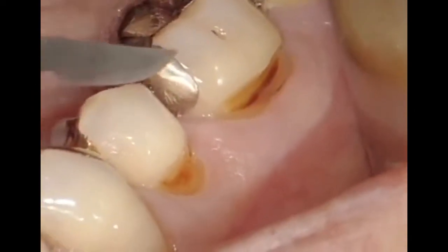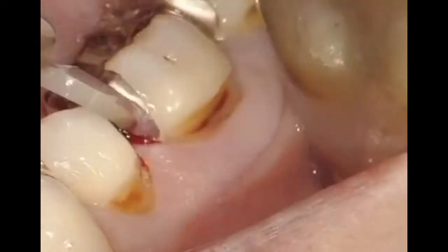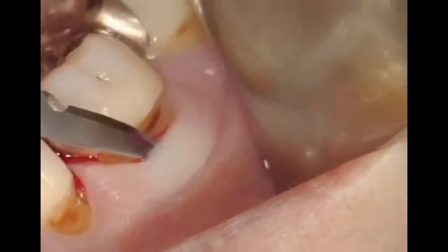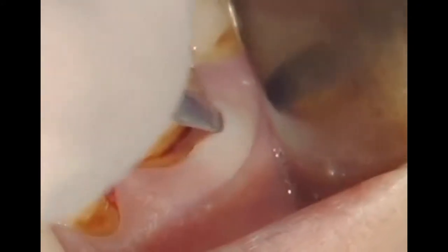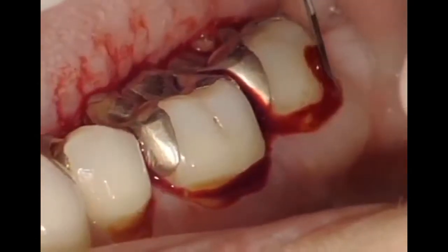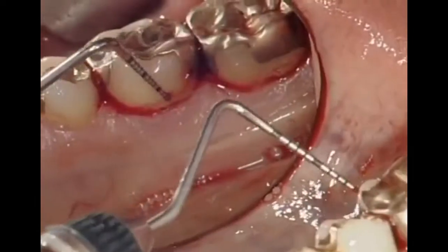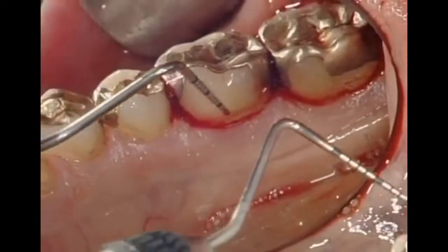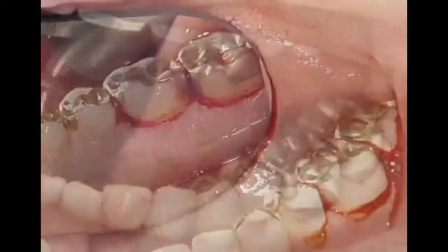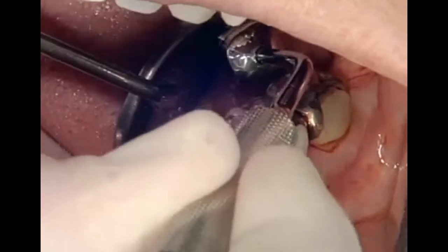After local block anesthesia, an intrasulcular incision is made using a 15C blade. To have good access to the periodontal defect, the incision is extended over several teeth. If possible, relieving incisions for better wound healing should be avoided. The same incision technique will be applied on the lingual side. The intrasulcular incision on the lingual side is more easily done by using a Blake's knife.